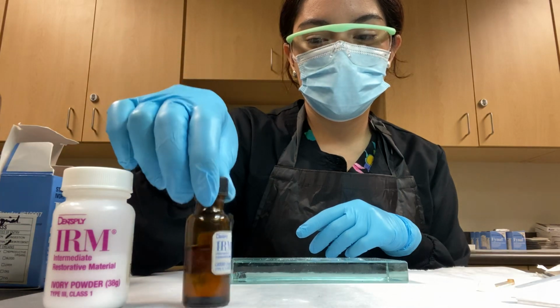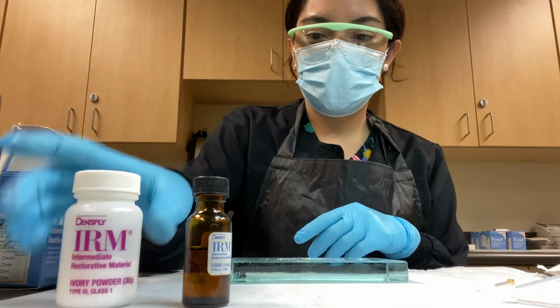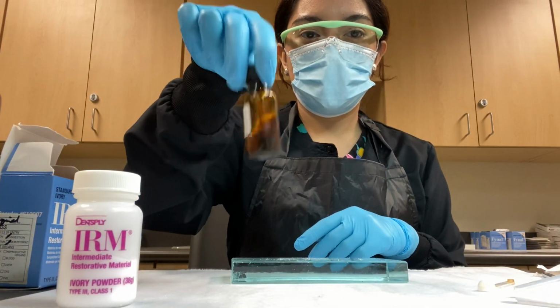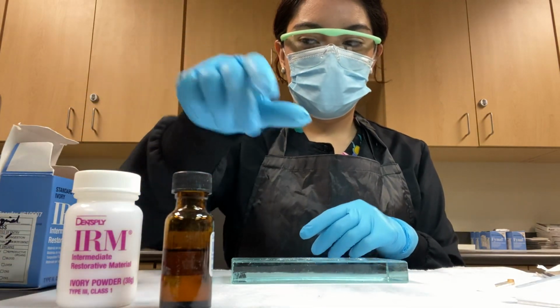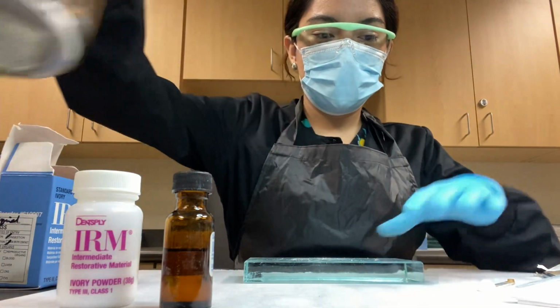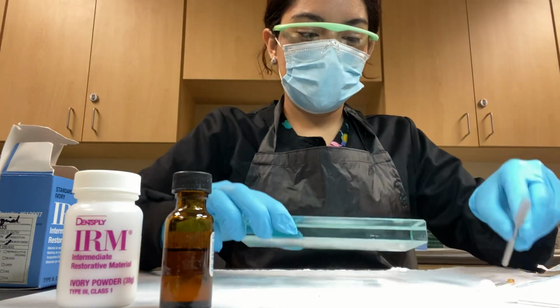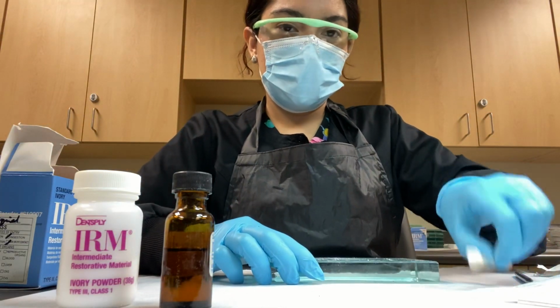And so initially, first we have to fluff the powder and prepare this as well. And I have my alcohol gauze pads in here. I have my stainless steel spatula, my glass slab, and my scooper.